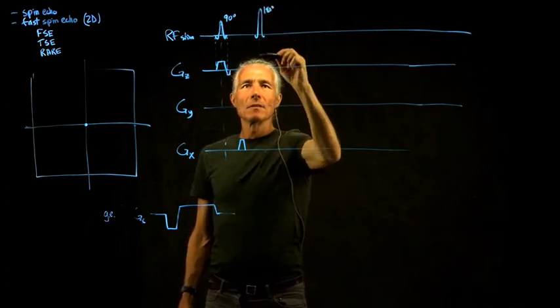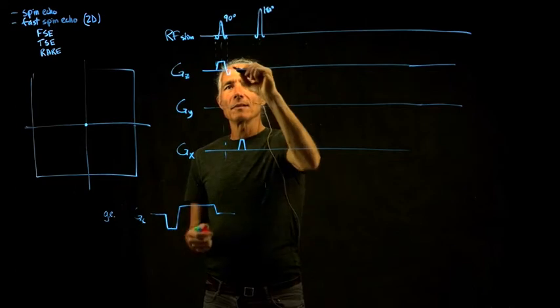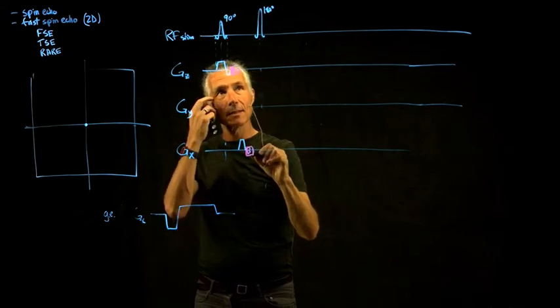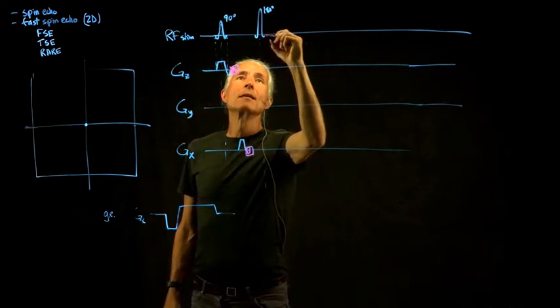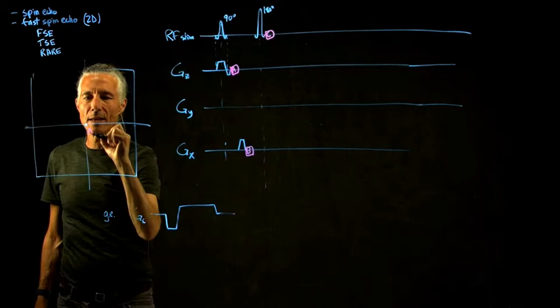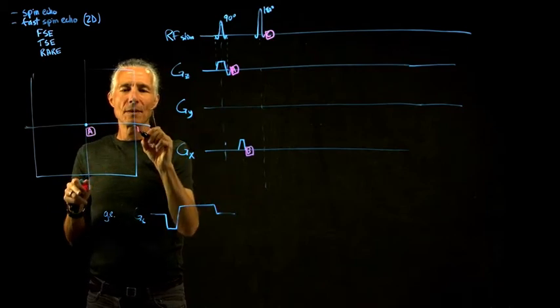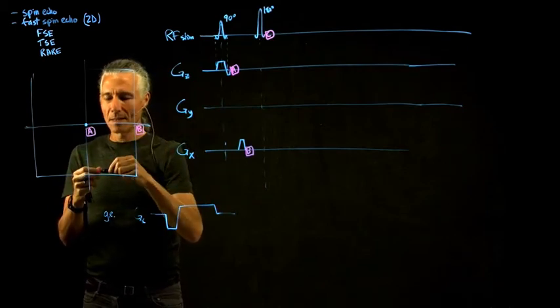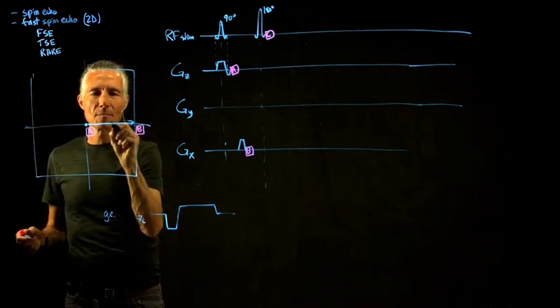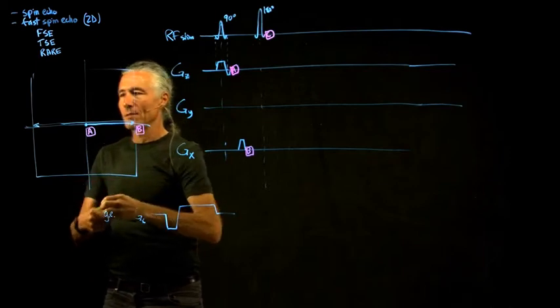And so that will flip things. So just like last time, here we're at the center. We go back to the center of K-space, and then here we go to the right side of K-space. And then right after the 180, I'll put the C up there. So here's A. So we came out in the Z direction and went back here. And then we go over to B, go over to the right side, and then we go to the conjugate point, turn around and go to the conjugate point over here. So that was the RF pulse. So that was C.